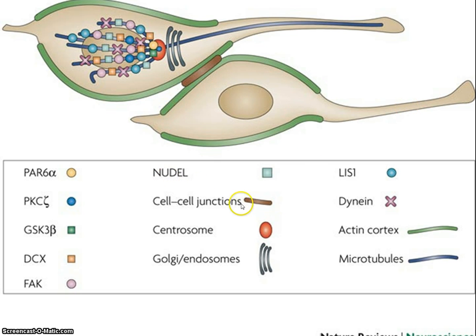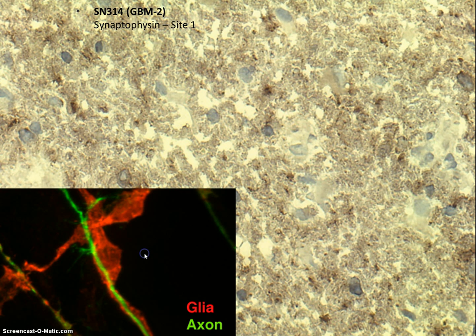So there's a cell junction that's involved, and then, as we'll see, we'll focus more. This is where the vimentin, the nestin and the vimentin become important in thinking about the inner workings of the cell, of how to squeeze out a leading edge, attach, and then pull all the guts up to that point. Nestin and vimentin are going to, as well as many other molecules, of course, contribute to that. But these are the things we have to think about, what's going on. Well, let's start first with the first result here.